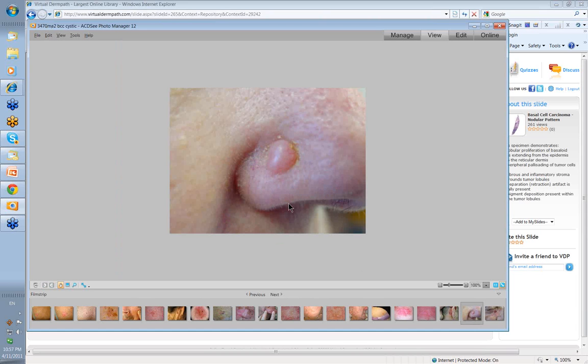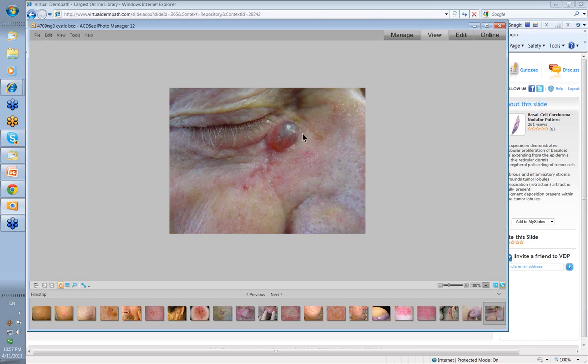That's another more typical cystic-looking basal cell skin cancer. What happens with these is that you get degeneration within the nodules that we showed you there, and a space appears within them. I think there's another example here with the cystic BCC. You can see the blue clods that are part of this as well.